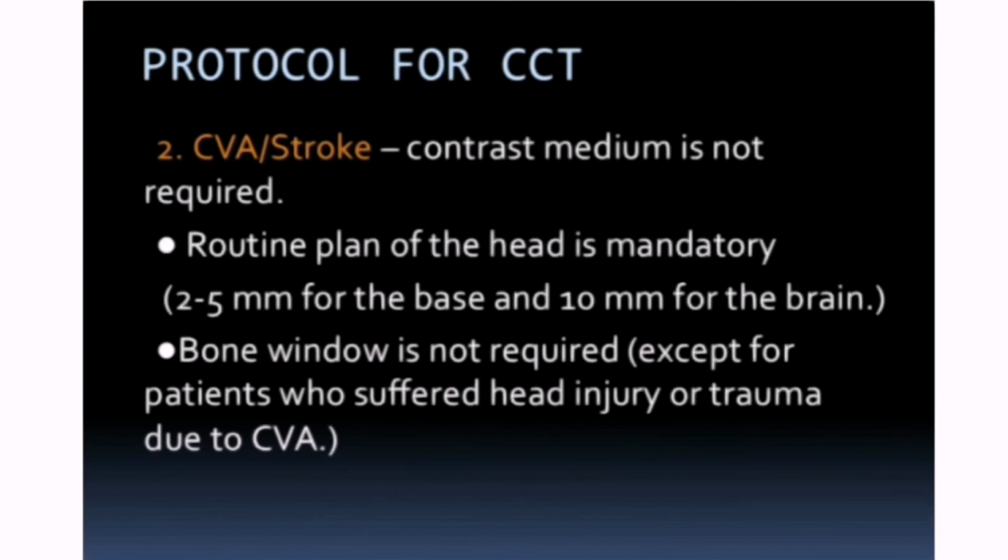For CVA or stroke patient, contrast medium is not required. Routine plane of the head is mandatory. Bone window is not required except for patients who suffered head injury or trauma due to CVA.